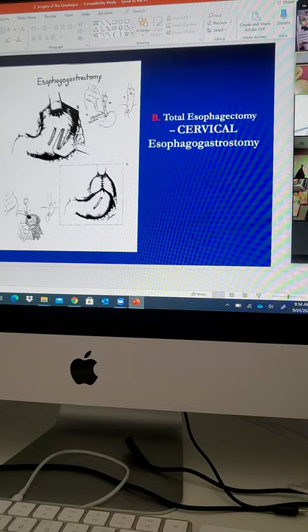Some of them you can load 7 times, only 8 times. So this is a disposable whole device. And when you load those staples, you can load it for a certain period of time. And when you're reloading it, this has to go in the water. You have to rinse it because sometimes those little staples can get stuck somewhere. And then if you put it back in the body, they can get loose here.